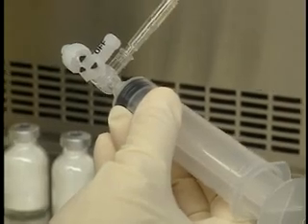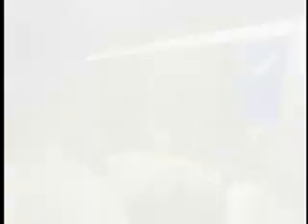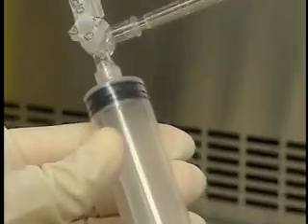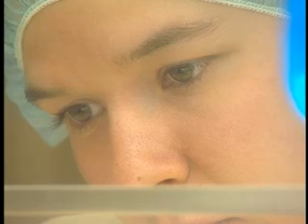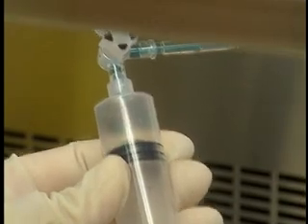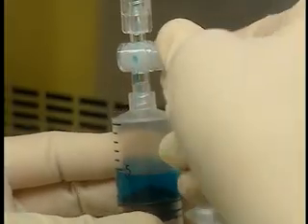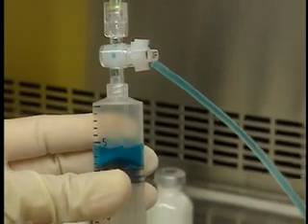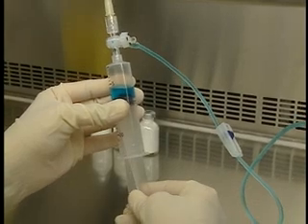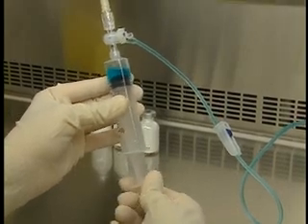Remove the cap from the valve's needle site and attach a needle to the valve. Unclamp the tubing and open the valve in the direction of the solution. Keeping the syringe at a 70 degree angle, draw in fluid until all the air is eliminated from the tubing. Bring the syringe to a vertical position and eliminate any air bubbles. Gently pull on the plunger end plate, then expel the air in the syringe by pushing on the plunger until you see a drop at the tip of the needle.